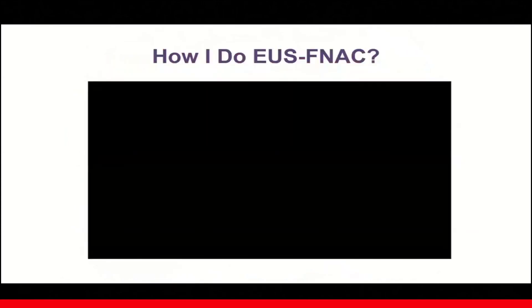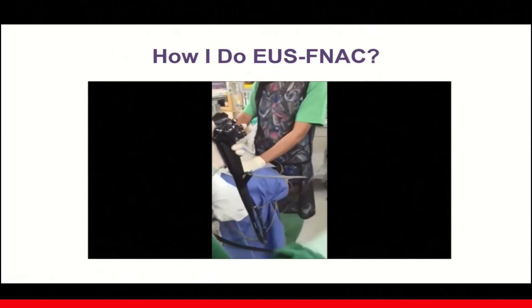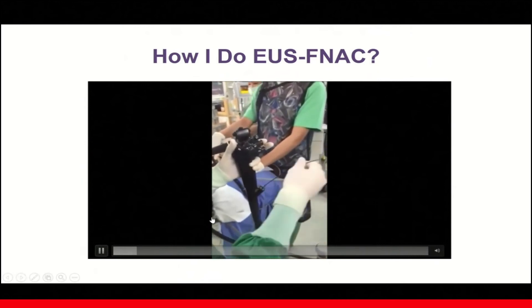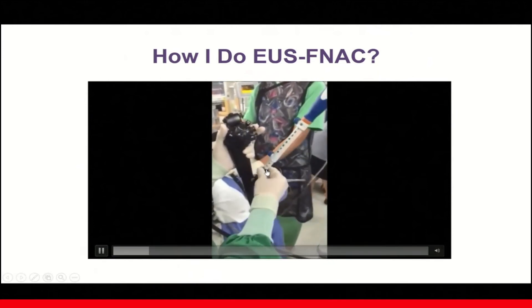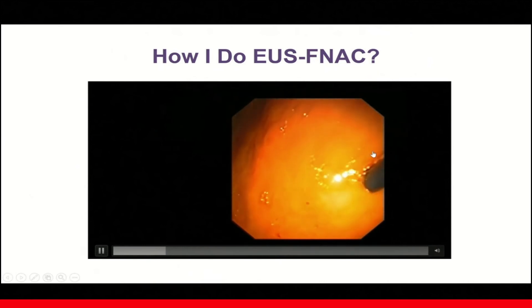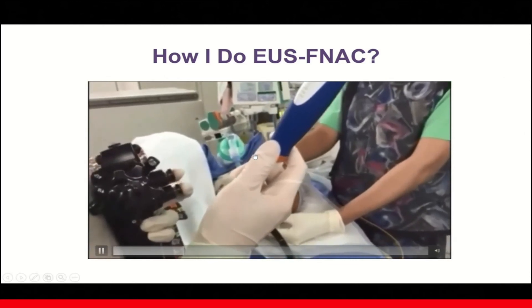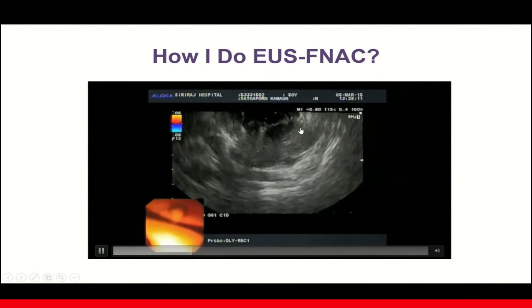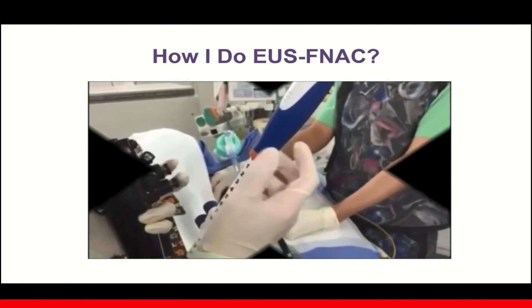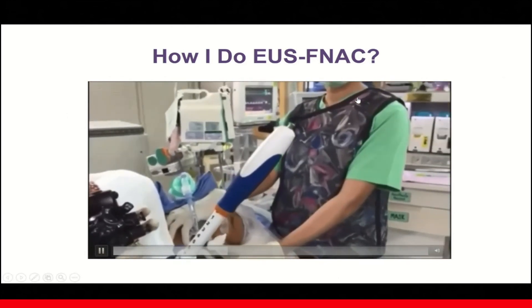Before I finish, here is a video of how I perform EUS FNAC. Starting with inserting the FNA needle through the working channel, you want to tighten up the needle. After the needle is locked, make sure the sheath is out of the scope to prevent scope damage when you pass the needle. Then the stopper is unlocked, and we use Doppler at this point to make sure there are no intervening vessels in the needle passage. Once confirmed, we pull back the stylet a little bit and advance the needle in.